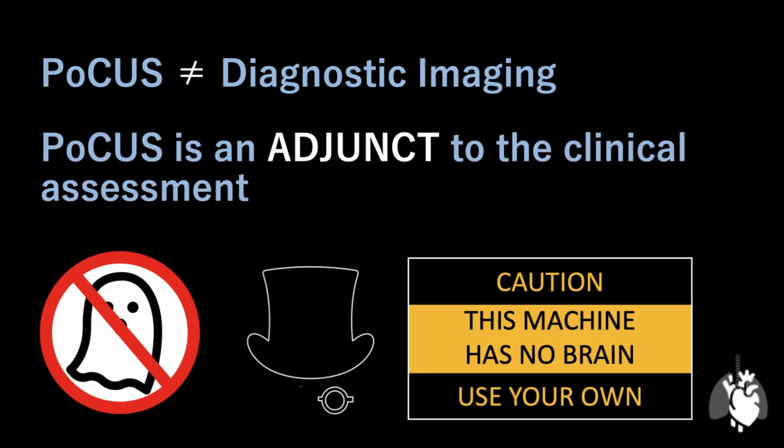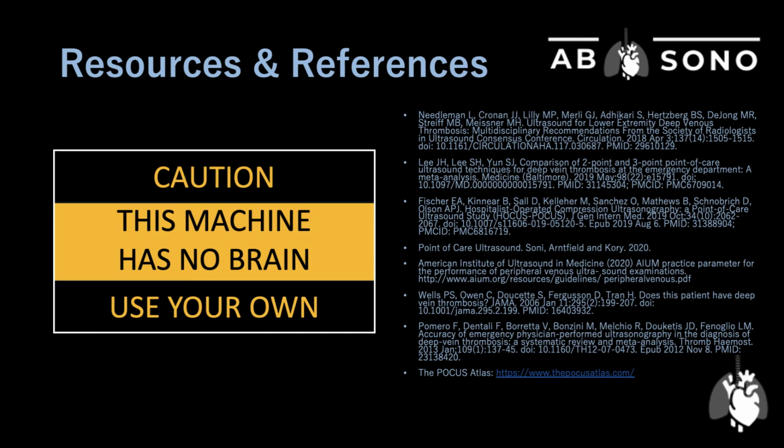The POCUS exam for DVT is technically challenging, but of tremendous value to clinicians who are able to carefully assess patients. In the right hands, POCUS can assist by expediting the time to treatment for high-risk patients with DVT and safely defer therapy in low-risk patients while awaiting definitive imaging. POCUS should never be used as the definitive test for DVT, but it sure can be helpful in the interim.